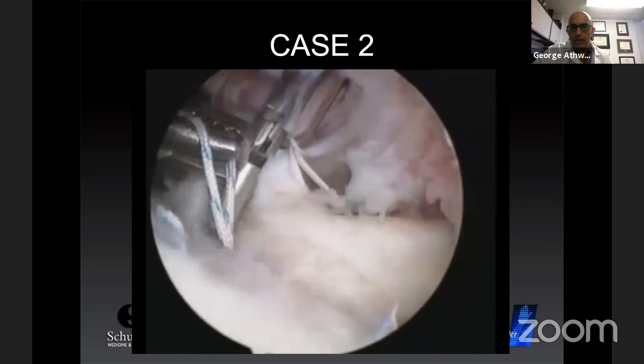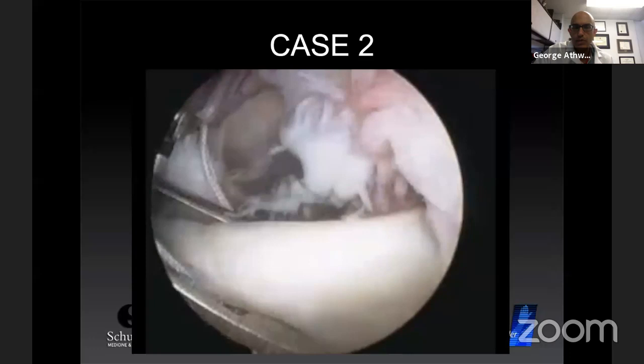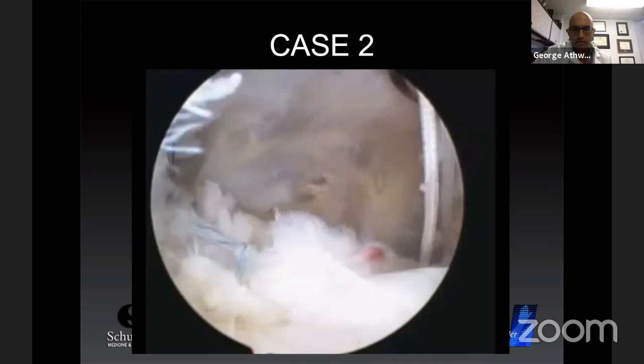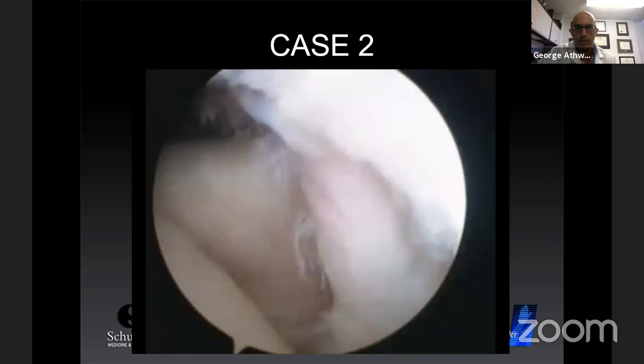So here we come in again with the anterograde passer. This is the same portal, that same anterolateral portal. So this is once again an intra-articular repair technique. And then we'll go ahead and tie these. And there you can see the subscap sit right into that lesser tuberosity. There we go. And this is the repair after it's done. And we can go ahead and move on.